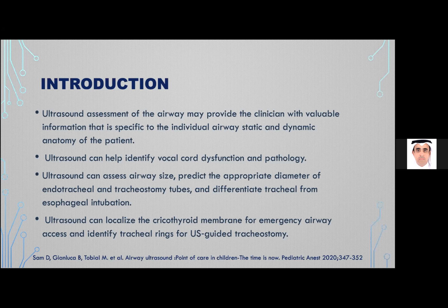After that, you can rotate the probe 90 degrees. This will show the tongue muscle, and you can see the long cut for the tongue, the other cut for the muscle in the floor of the mouth, and the other cut for the mandible and the artifact.